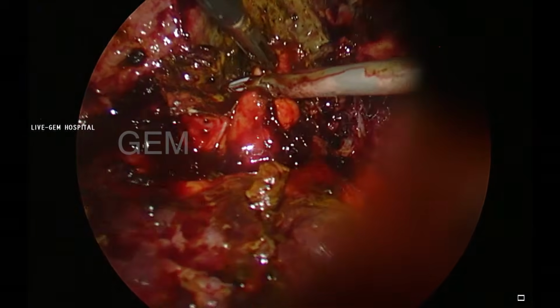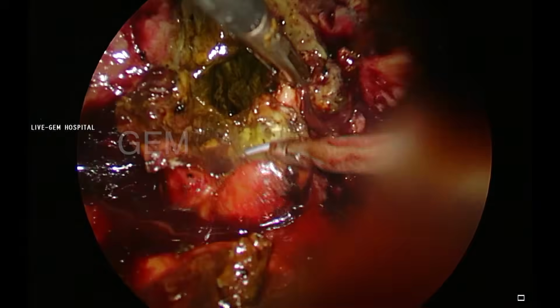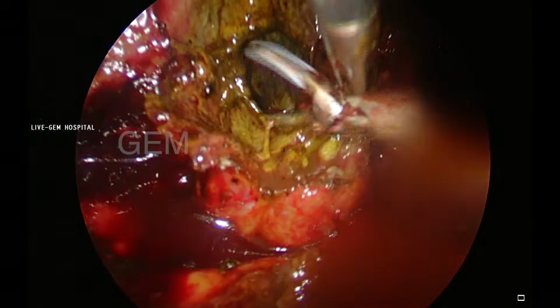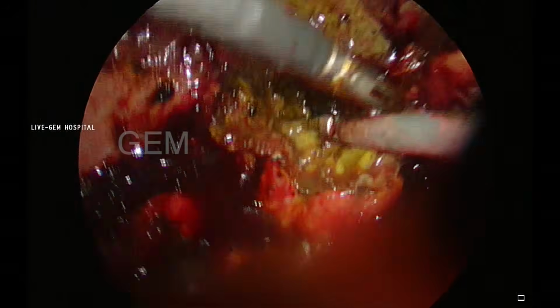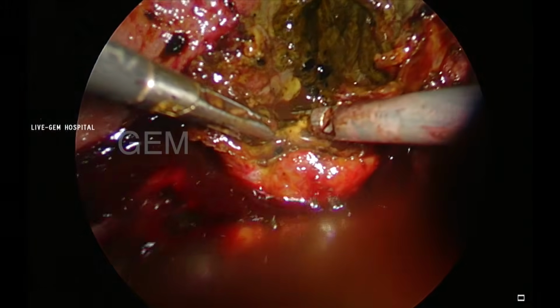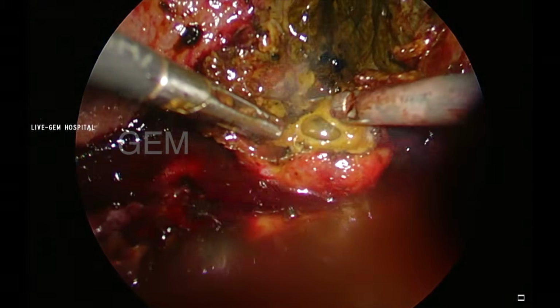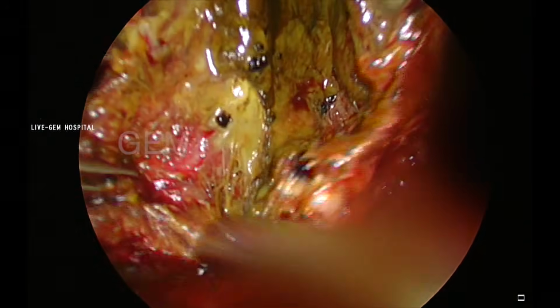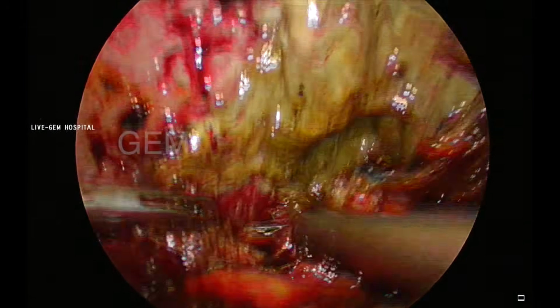So that's why, when you're going for a type 2 subtotal cholecystectomy or type 3 subtotal cholecystectomy, you have to take out the entire mucosa of the infundibulum. That is considered very, very important. Otherwise, the secretion will form, it will distend, and it will enlarge the infundibulum. It looks like a part of the gallbladder on the imaging studies.